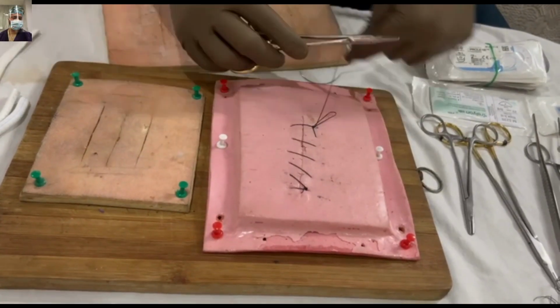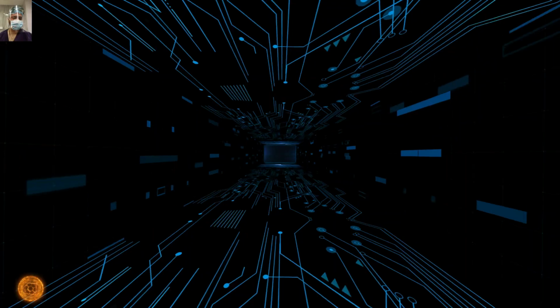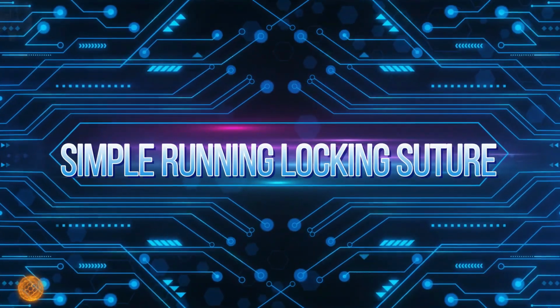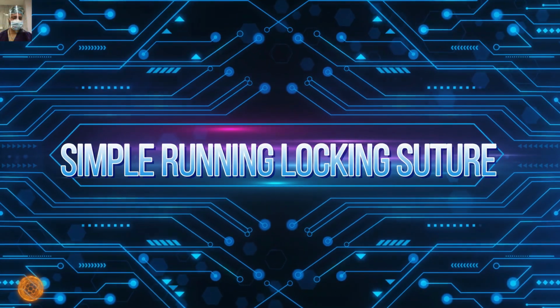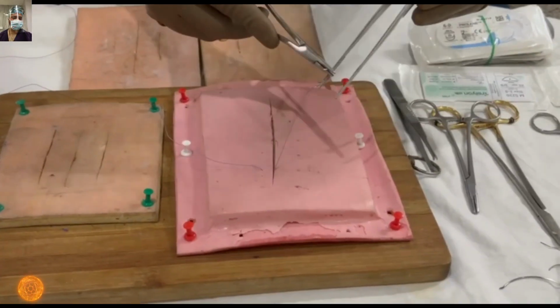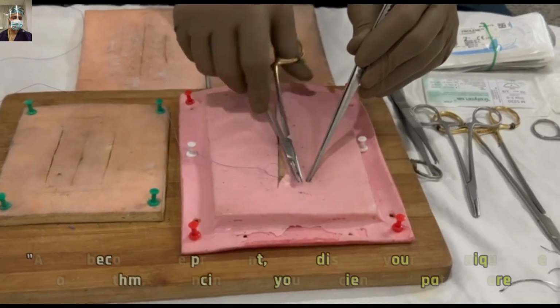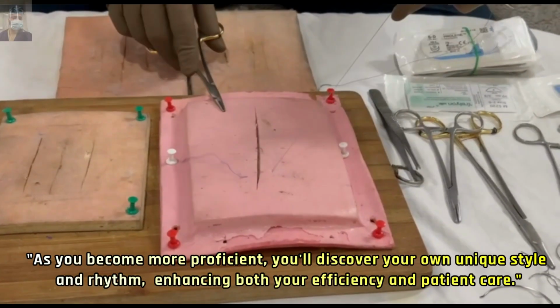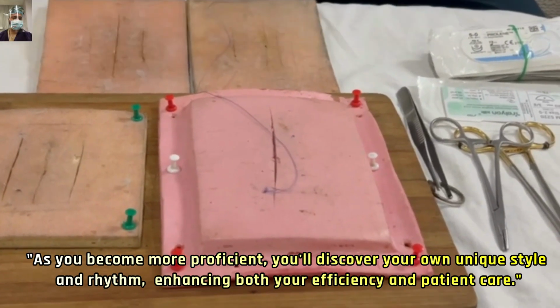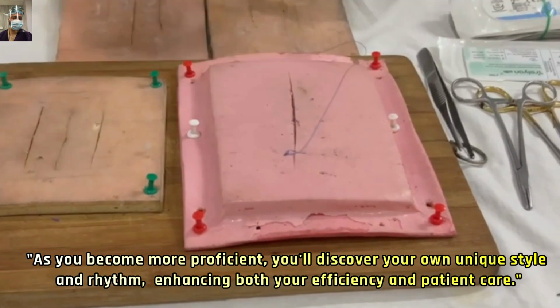The next suturing technique we'll share will be the simple running locking suture. So friends, it is just a simple variant of the simple running suture, but here we apply a lock between the two suture throws so that if somehow you divide the suture accidentally somewhere in the middle, the whole length of the suture will not get loose.